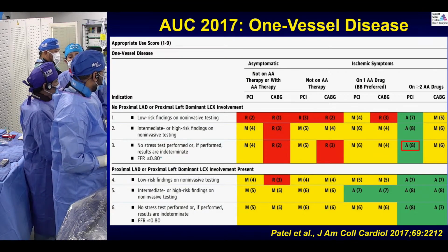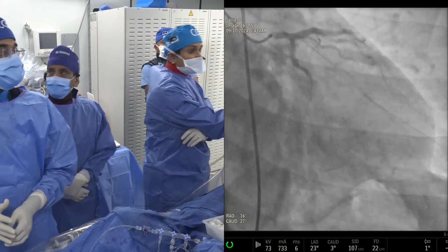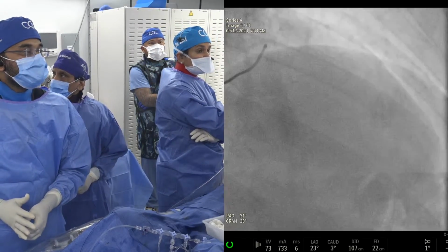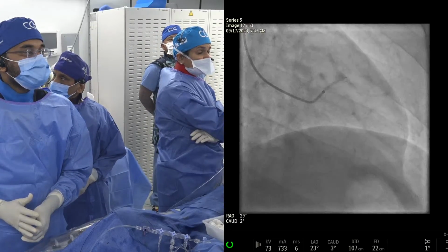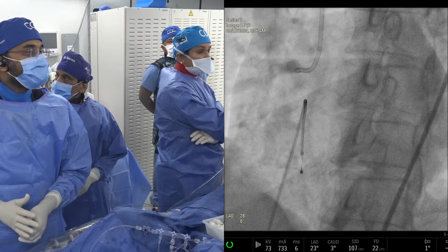With that note, Anu, you want to show where we are? Go back to the angio now. So this is his diffusely diseased circ, but the LAD stent looks okay. EF is good. EDP was normal. And this is his right coronary artery.